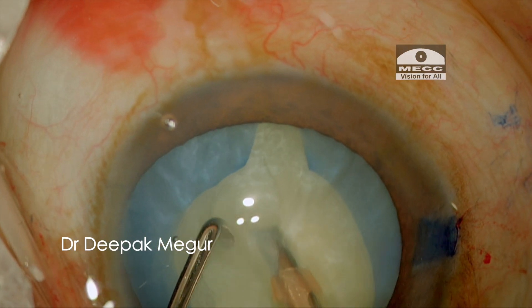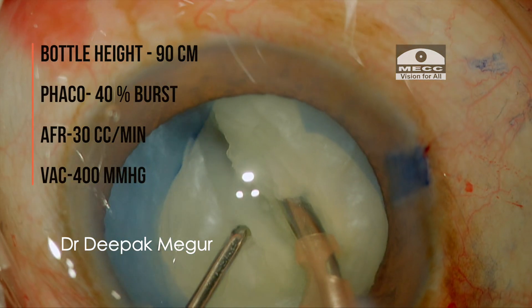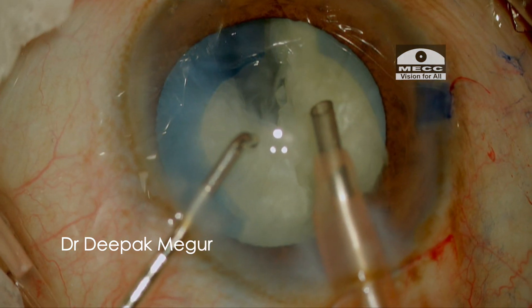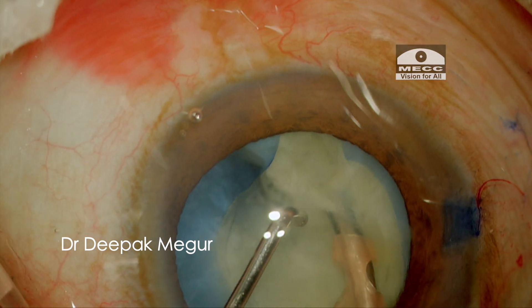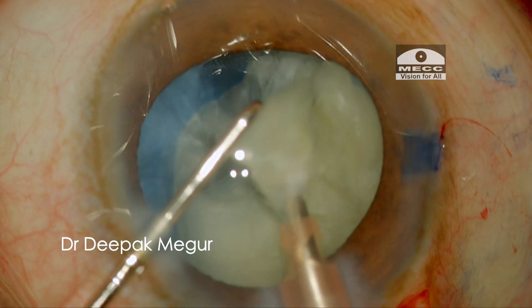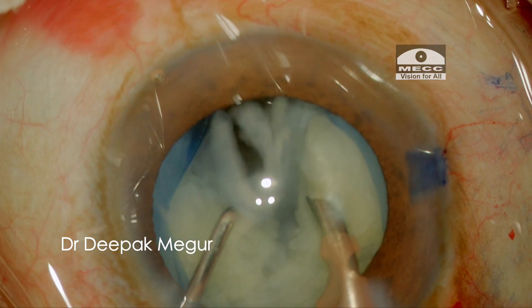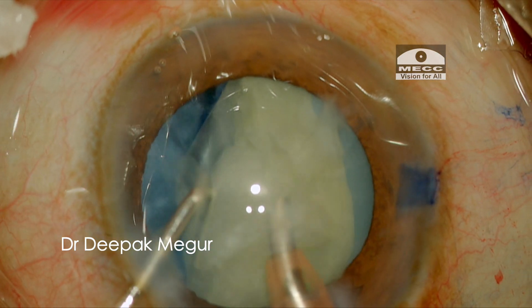Keeping one eye on the anterior capsular flap, I proceed to perform my FACO chop, gently in a controlled manner without exerting much pressure on the bag during lateral separation. The first piece is then aspirated without rotating any fragments. Without rotating the nucleus, the second chop is created and the fragment emulsified in the supracapsular area. Now we have got some space in the capsular bag. The third fragment of the nucleus is then gently maneuvered before consuming it. And at every stage, I can clearly see that the anterior capsular flap is everted and fluttering.